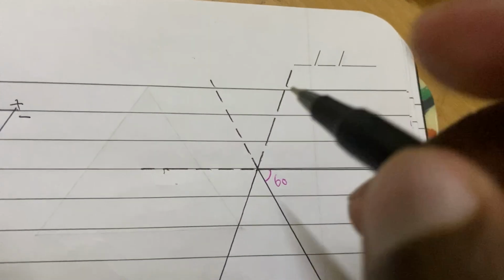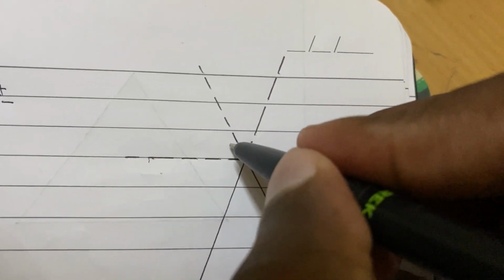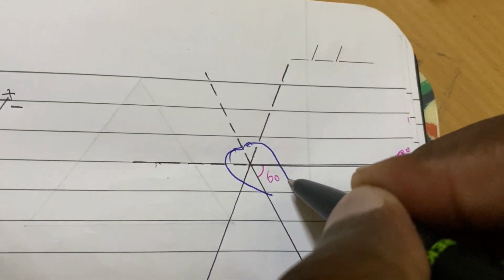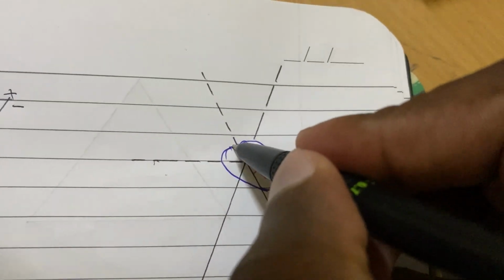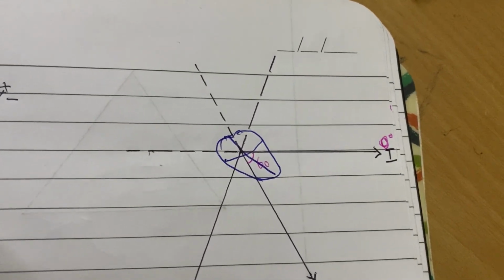Remember what we said, that if you were to view the heart, these angles are not enough. For example, if we say that that is our heart, the arteries are here, these are in the frontal plane.